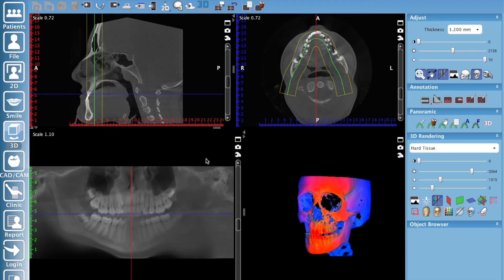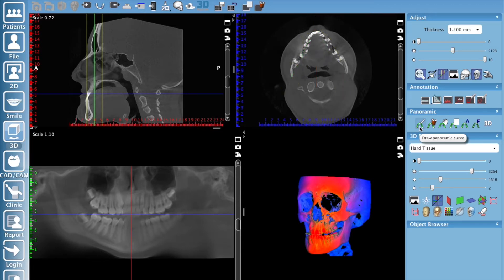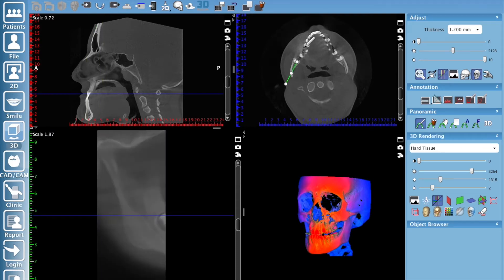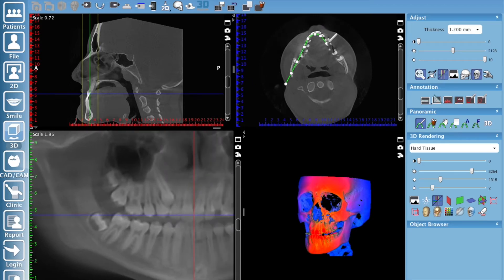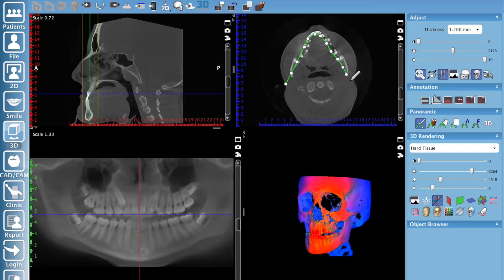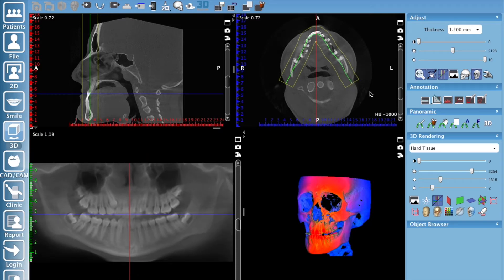You have a couple of options to make this look good. The software does its best to create the panoramic curve, but typically that's not always ideal. So you can do what a lot of radiologists will do — they'll create their own panoramic curve. Select this icon here, it's just a simple pencil. You left click and every time you click it sets a point, and when you're done just double click and that'll finish it up.